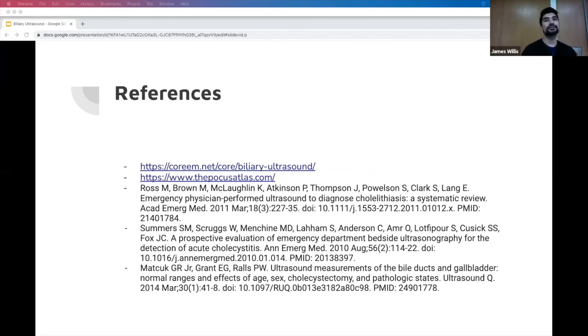Yeah, Robbie? I guess a comment to the question. It's common to consider other perks of ultrasound, like point of care, especially patient-oriented outcomes or even hospital-oriented, admin-oriented outcomes. At some places where you can have a bedside ultrasound that's diagnostic, surgery will just take the patient. So I think two perks of ultrasound would be decreasing length of stay and also decreasing radiation, both patient-oriented outcomes.